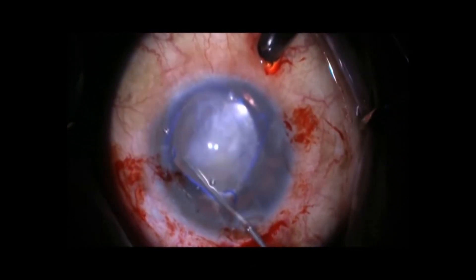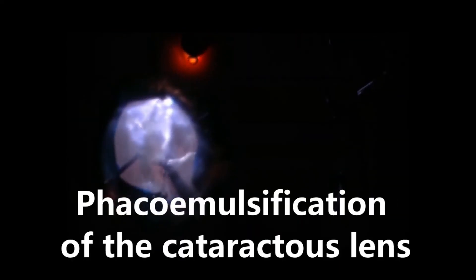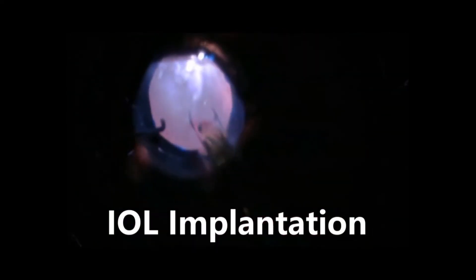Capsulorhexis was done with endoilluminator and microscope illumination. Hydrodissection was done. Nucleus was fragmented and emulsified with retroillumination by chandelier. Cortical aspiration and IOL implantation were done with chandelier assistance. AGV implantation with graft was completed. Post-operative vision at 6 weeks was 6/24 and N24.